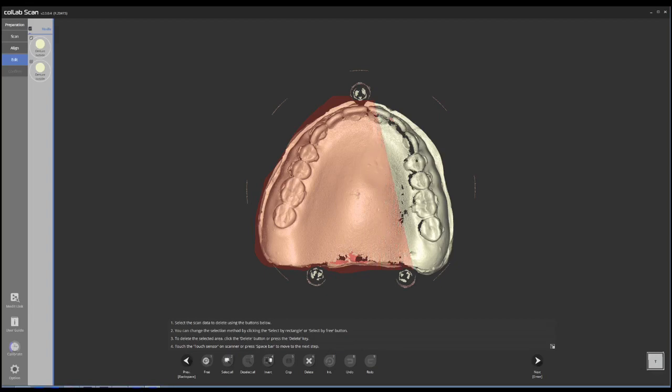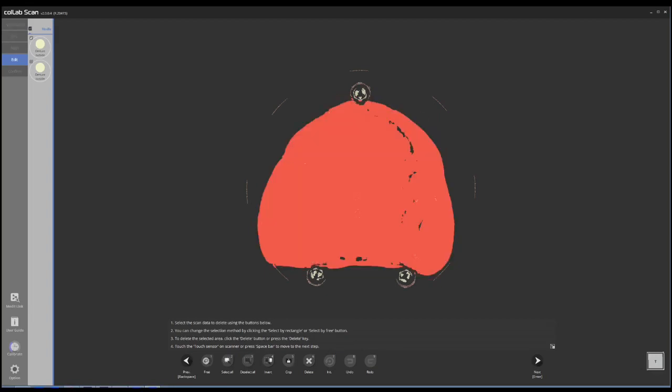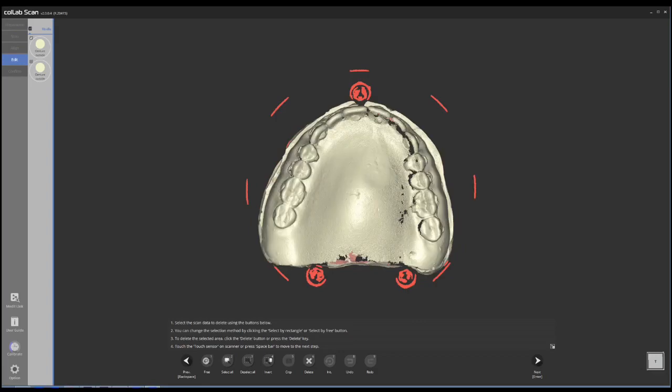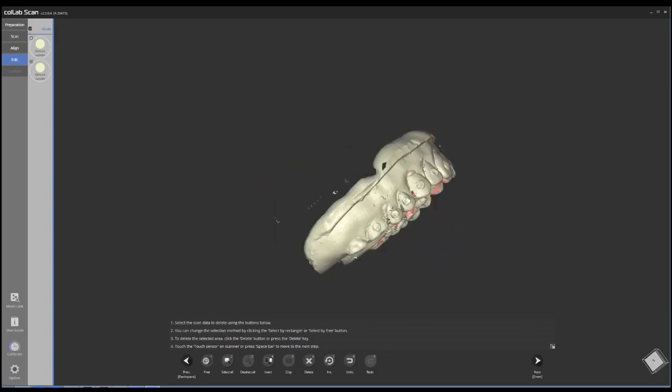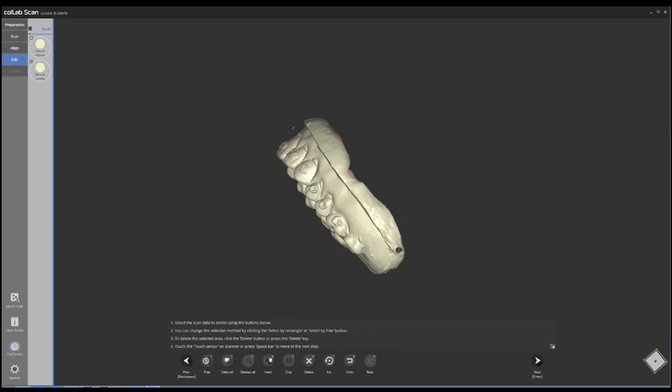So I'm going to select the denture, crop it. There might be a couple extra data here and there. Use the lasso tool, select them, delete them. And then you do the same thing for top and bottom.